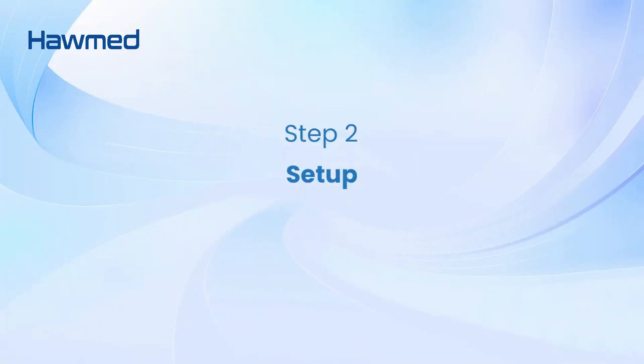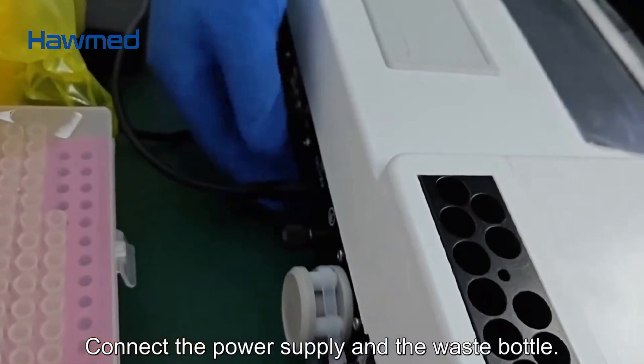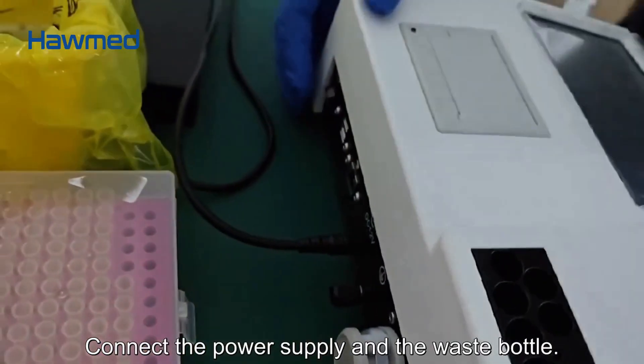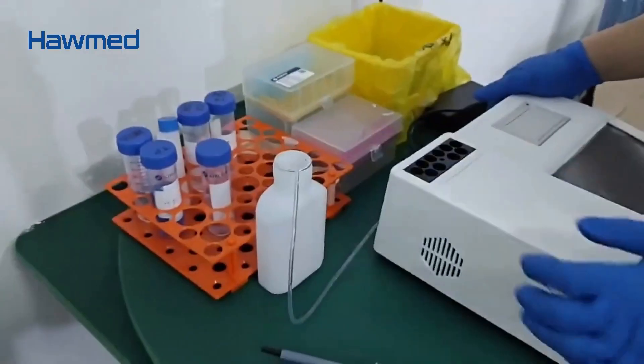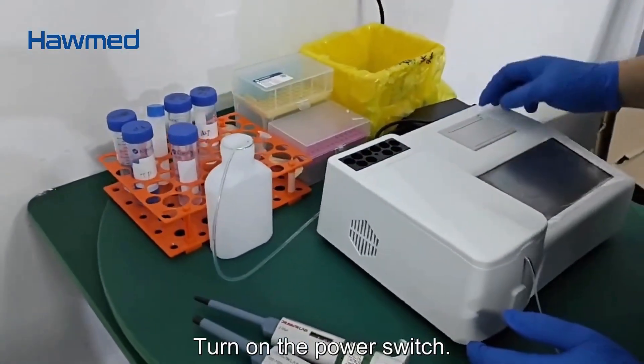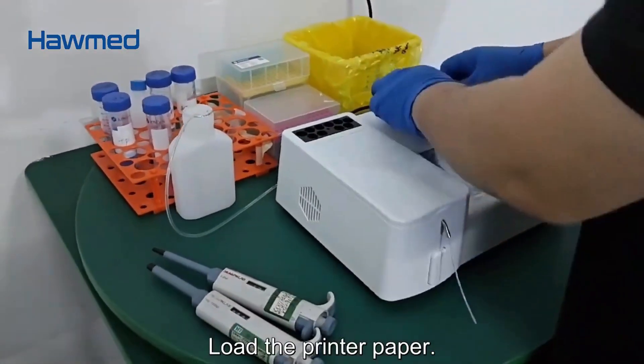Step 2: Setup. Connect the power supply and the waste bottle. Turn on the power switch. Load the printer paper.